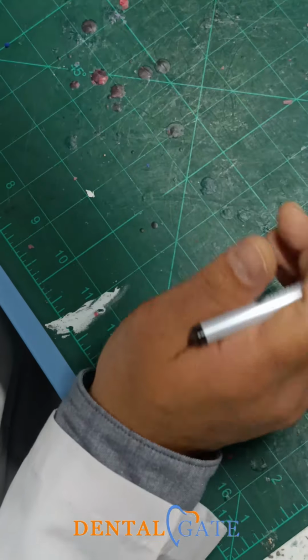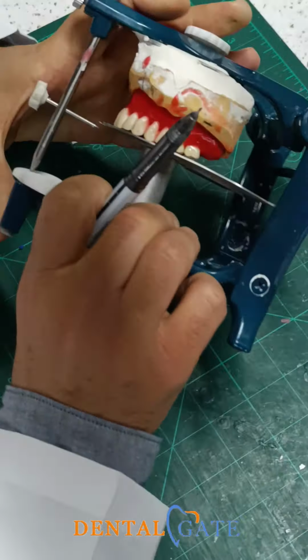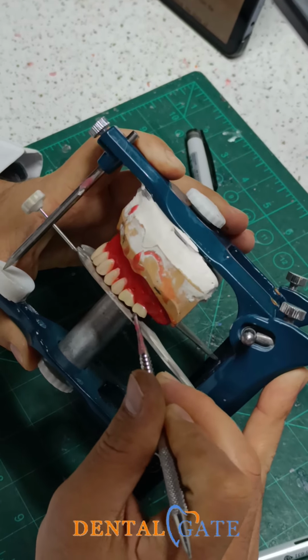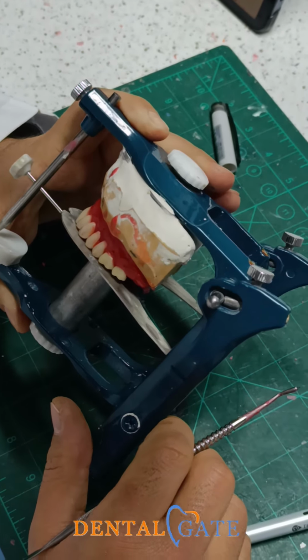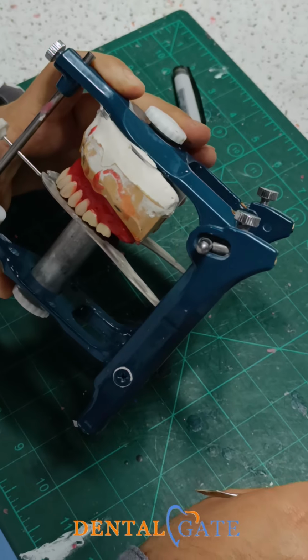Follow the curve. So check the space regarding the upper 7. It is a severe space, okay? Touch with the lower.